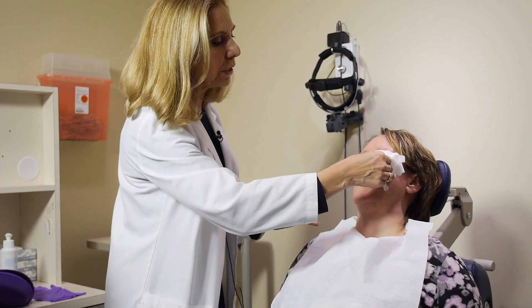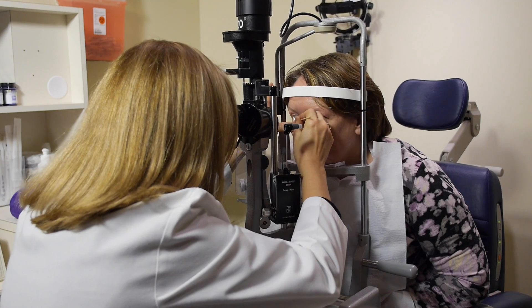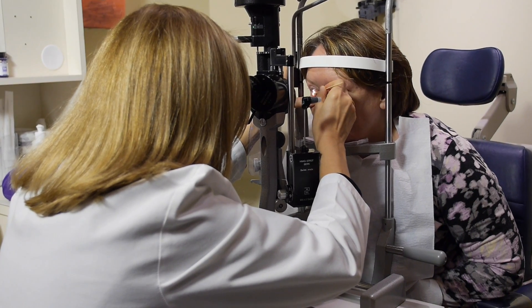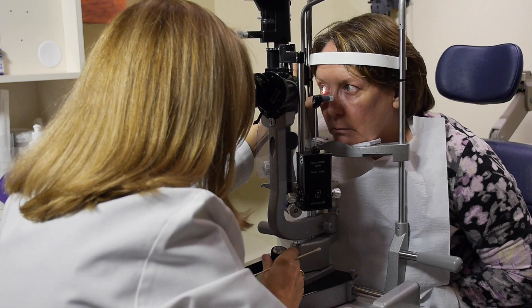Once the gel is wiped off and the IPL is done, we work on each individual gland along both lower lids to express the old unhealthy meibum from the meibomian glands. The goal is to make the meibomian glands healthier.